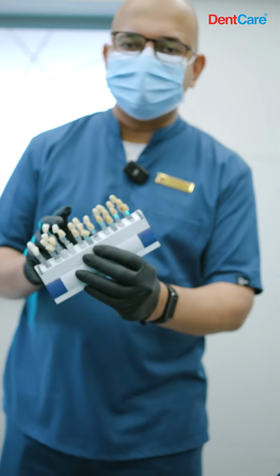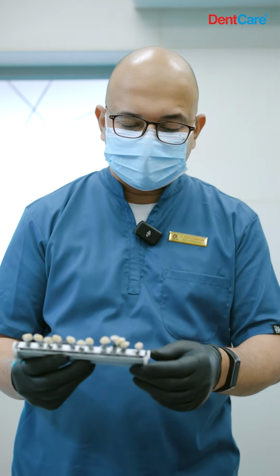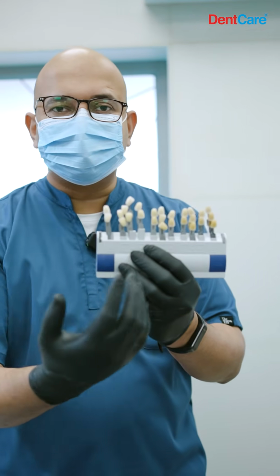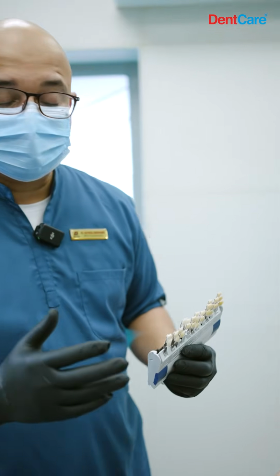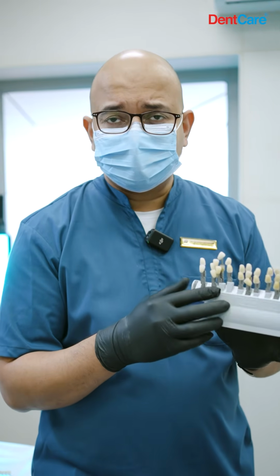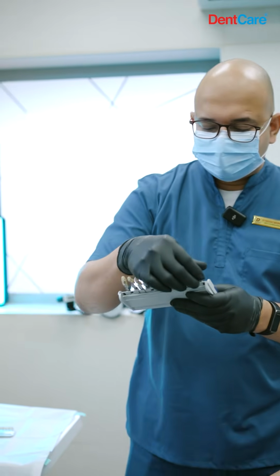Okay, so we're going to use the 3D Master from Vita. It's the two-guide 3D Master for shade selection. The first thing is to select the value. We've got the value groups as 1, 2, 3, 4, and 5. Looking at her, we're going to do the 2, 1, the central incisor. So we're going to select 1M2 and 2M2 in order to decide the value.